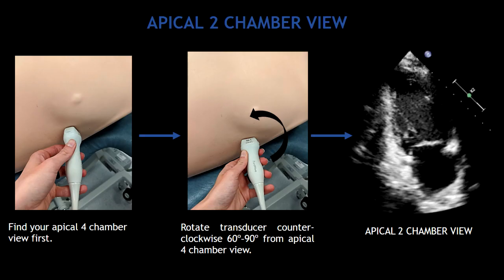Now the apical two-chamber view. To obtain this view, you have to find your apical four-chamber view first. From your apical four-chamber view, you have to rotate the probe counterclockwise between 60 and 90 degrees. The index marker is going to be pointing somewhere between the median axillary line and the clavicle.